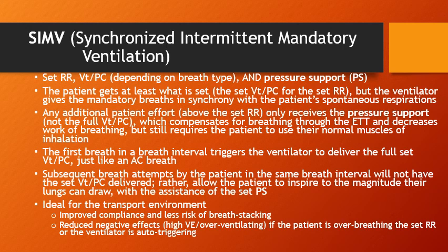There's also a reduced risk of negative effects like high minute ventilation and overventilating if the patient is tachypneic and overbreathing the set respiratory rate, or if the ventilator is auto-triggering, because any extra breaths above what we set are not getting the full tidal volume or pressure control.